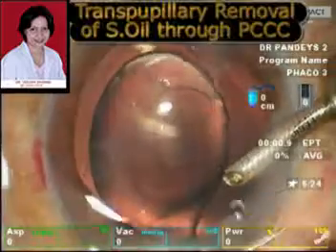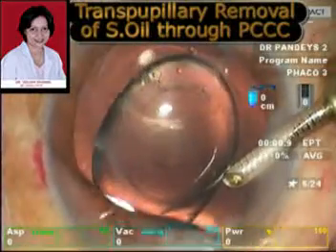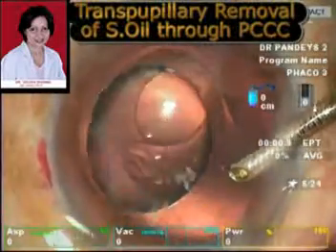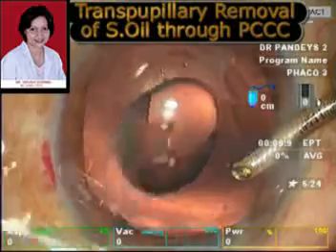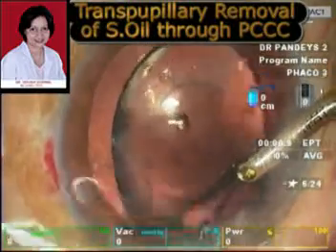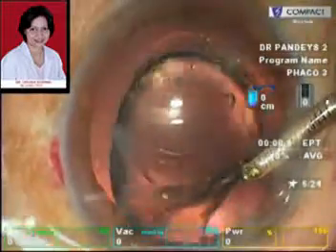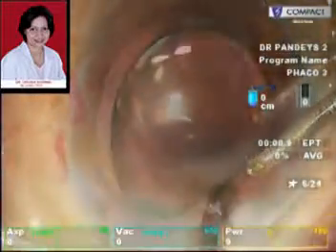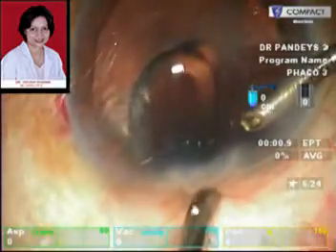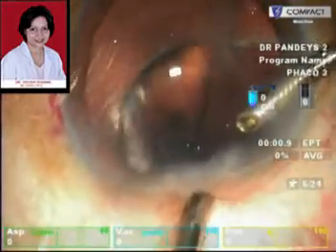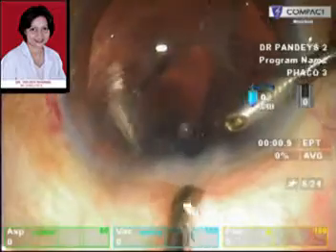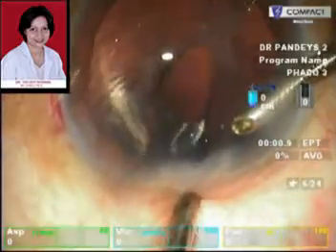The AC maintainer helps to maintain the pressure and avoids any rapid hypotony, which may be a cause for choroidal detachment. With the AC maintainer in place, we continue to depress the posterior corneal lip until the silicone oil has been completely removed.